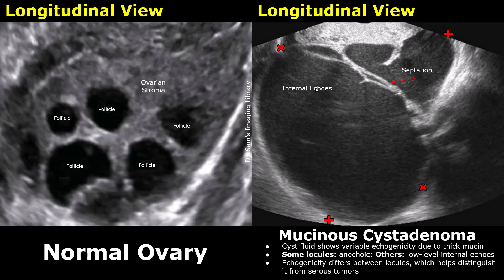On the right we see an ovarian mass. It is a mainly anechoic mass with some internal echoes and septations. These walls inside the mass are the septa. Instead of seeing a single cystic cavity, we observe multiple cystic compartments known as locules within the same ovarian mass. These locules are numerous, vary significantly in size and shape, and can be closely packed together. Because of this arrangement, the lesion does not appear uniform — instead, it forms a complex but organized cystic structure.